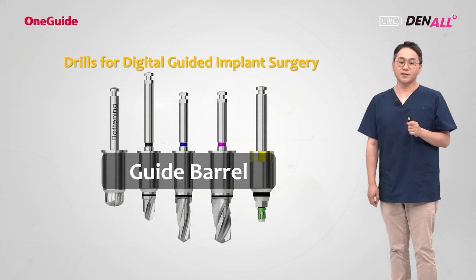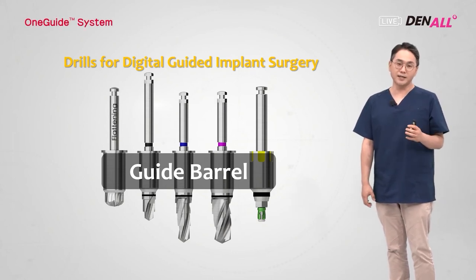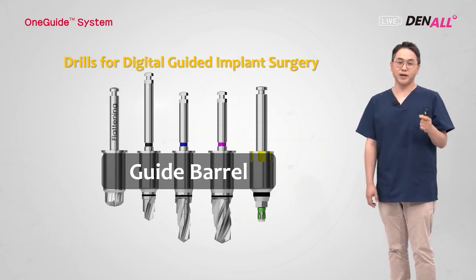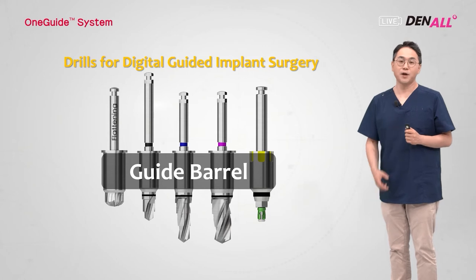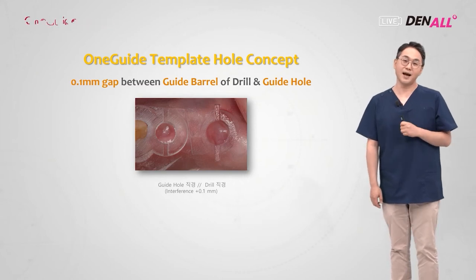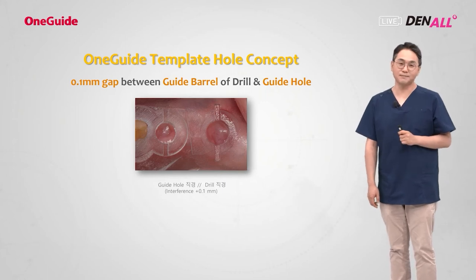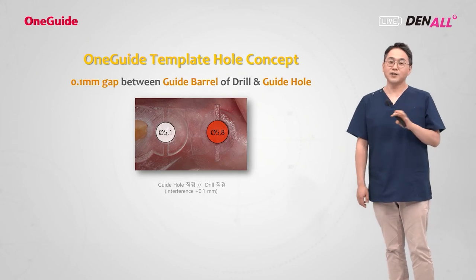Let me explain. There is this guide barrel. When it comes to the OneGuide kit, guide holes are used for drilling and the implant placement. That part is called the guide barrel. There are 2 sizes of the barrel. Because there are 2 guide hole sizes in the OneGuide template, let me add one thing. In the OneGuide template, there are 2 guide hole sizes, 5.1 and 5.8. It's not something we can choose.